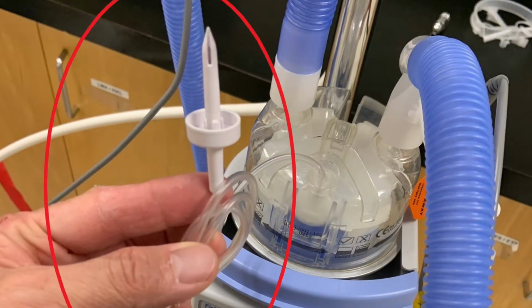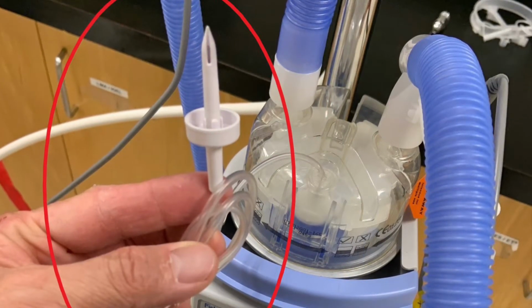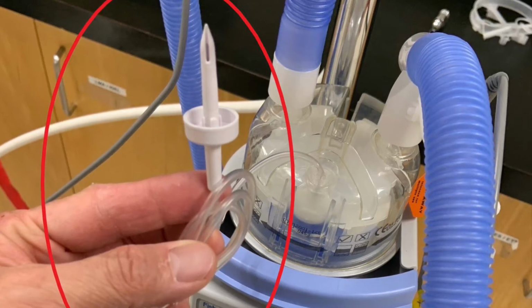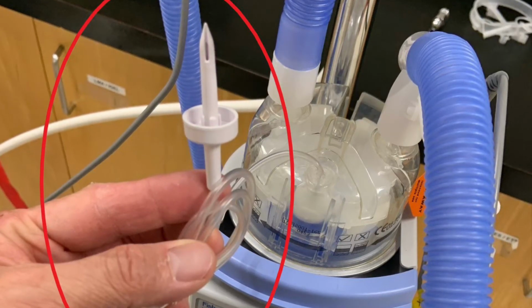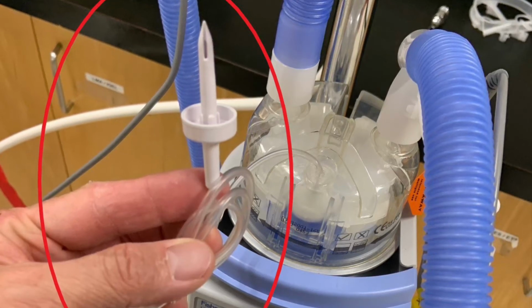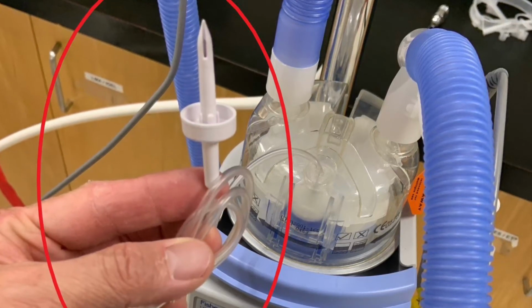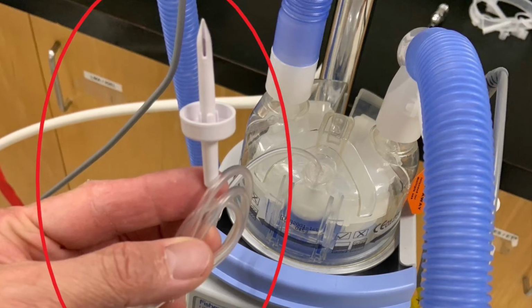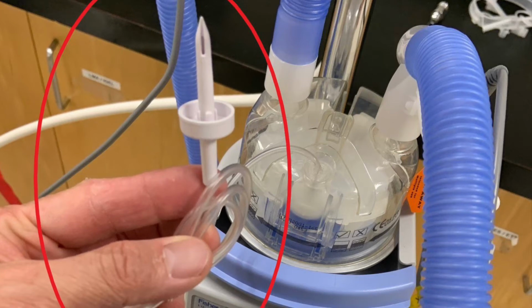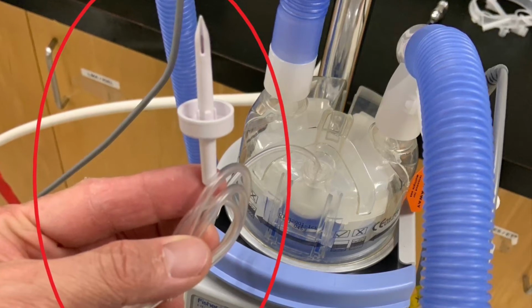This water chamber also comes with a white water spike you see here in the red circle. This allows you to hang a 1 liter bag of sterile water, or 500 milliliter bag, and you can puncture that water bag, and then you only have to change the water bag when it is empty. It maintains a much more sterile system, and you do not have to open the system to change the water.